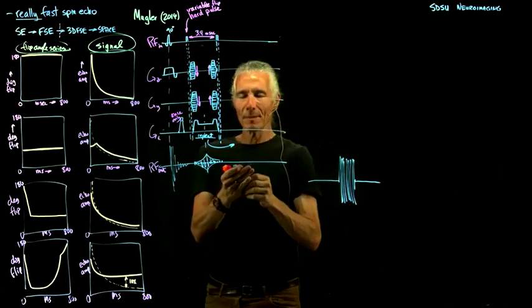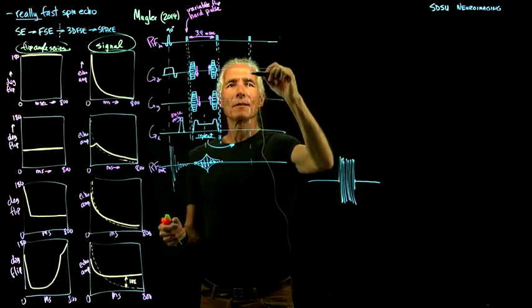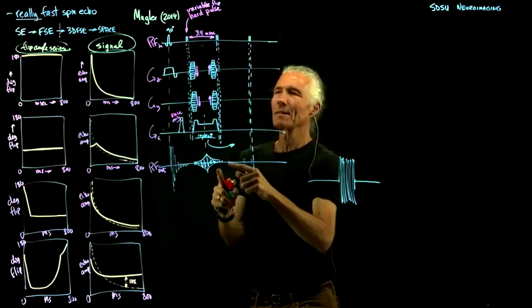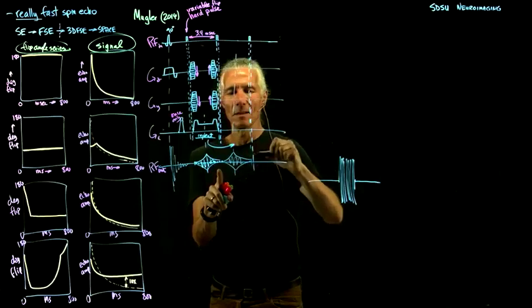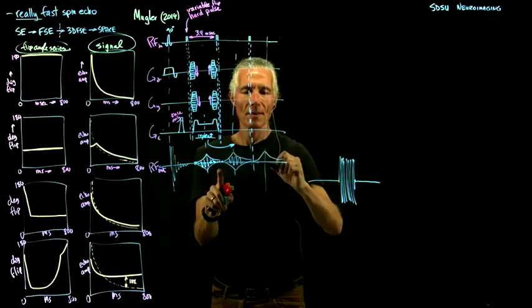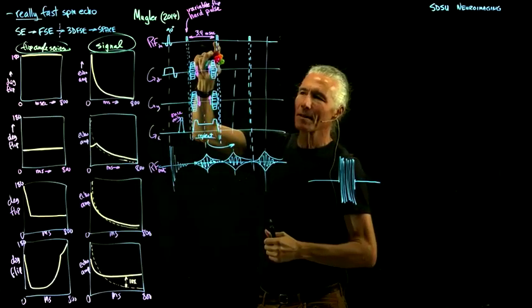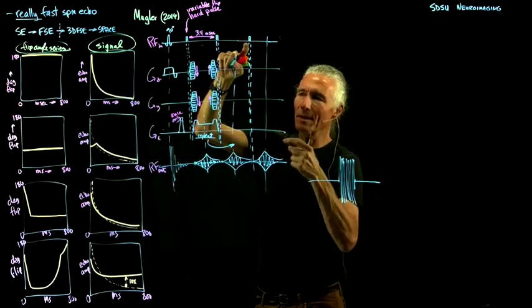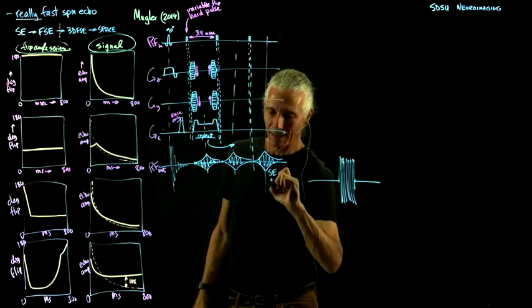But now what happens for the third one? After the third one, you'll get another spin echo over here. But after the third one, right here, because the second one saved some transverse magnetization in the longitudinal plane, when we do the third one, it will uncover that longitudinal magnetization back into the transverse plane, but sort of flip it and cause this rephasing to occur. So basically this guy will be a stimulated echo, plus a spin echo plus a stimulated echo.